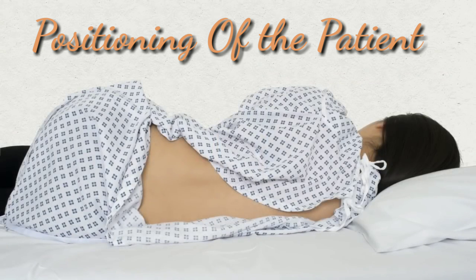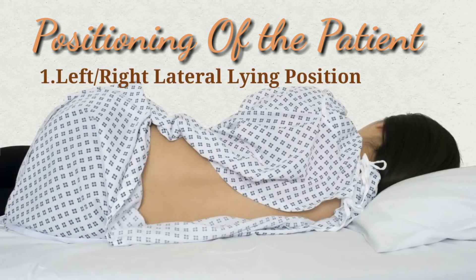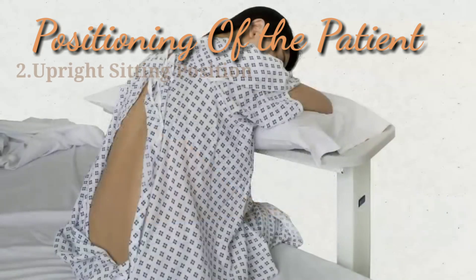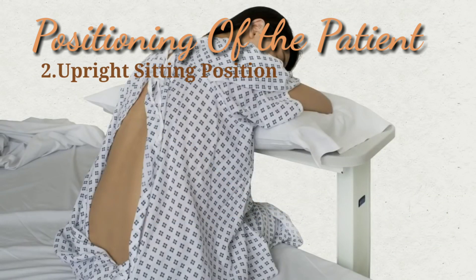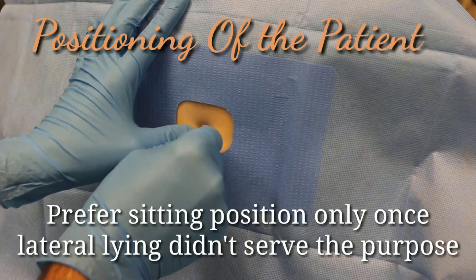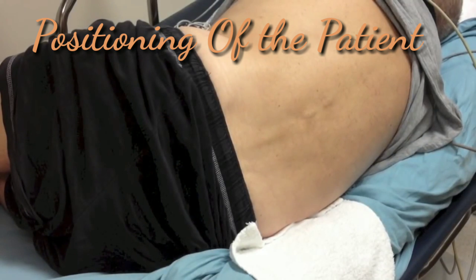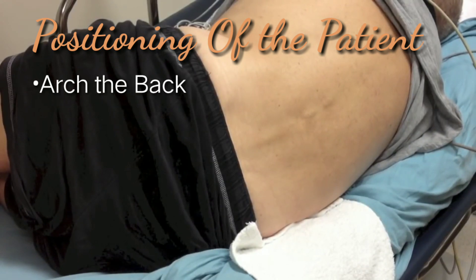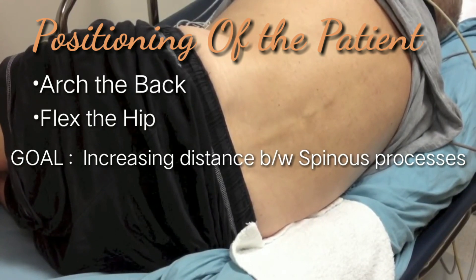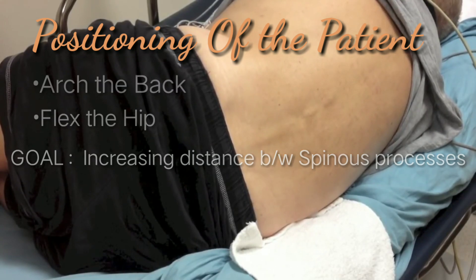There are two ways of positioning a patient for lumbar puncture: a left lateral recumbent position or a sitting upright position, depending on the patient's and practitioner's individual preferences. A sitting upright position is generally used when the lateral position has failed. In either case, you want the patient to arch their back and flex at the hip to increase the distance between respective spinous processes so that the needle penetrates easily.